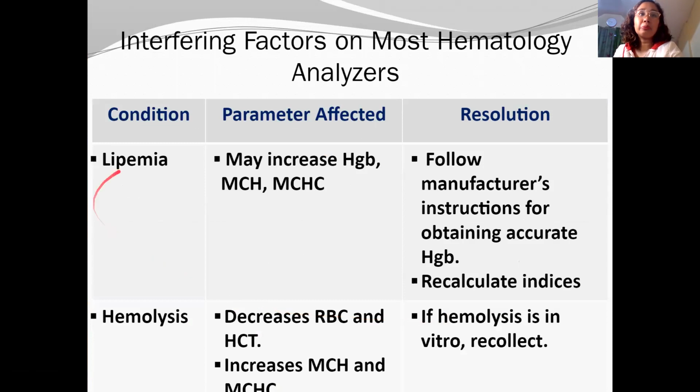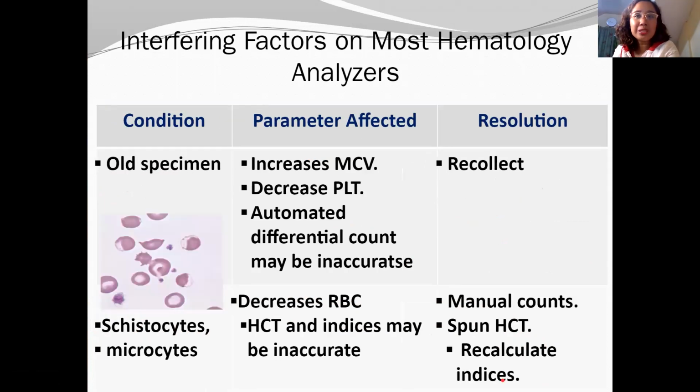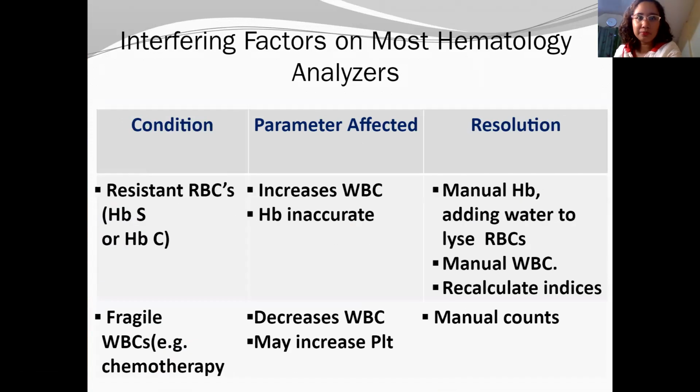What if there is lipemia? Just what I said. Follow the manufacturer's instructions. Hemolysis: the solution is to recollect. Old specimen: still recollect. If there is poikilocytosis, do a manual differential count and check the peripheral blood smear.